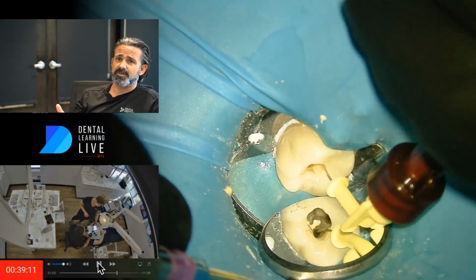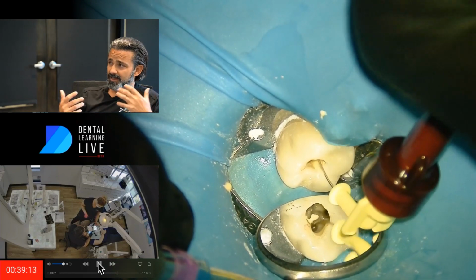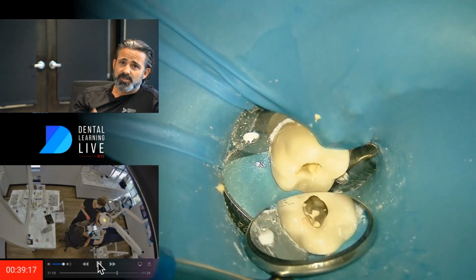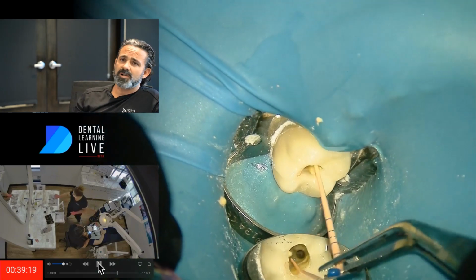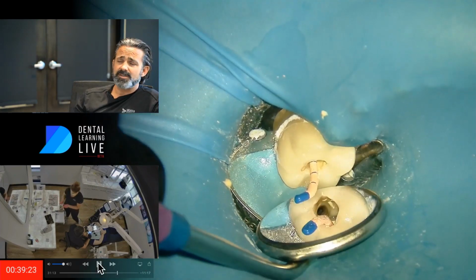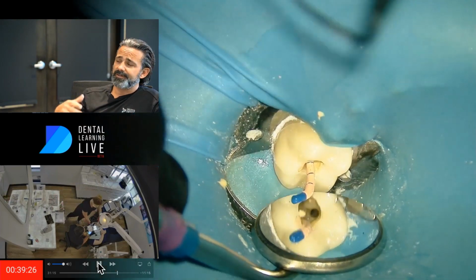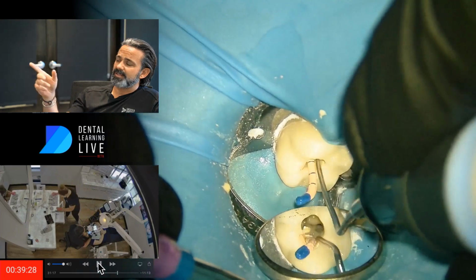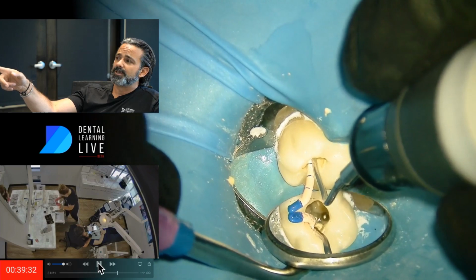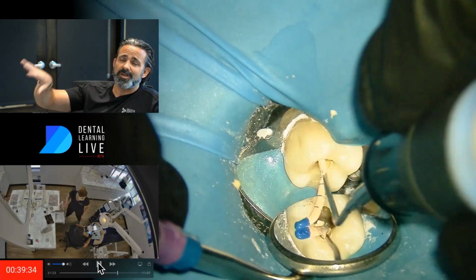And what I like to do is, some guys like to do everything at once, and that's fine. I don't like that. It probably is quicker to do them all at the same time, but I like to watch the flow of things. And so as you see me place this in the mesial buccal canal, squirted the sealer, and as I kind of push in, you'll see sealer come up the mesial lingual canal. Okay, so I know I got some fluid coming through.